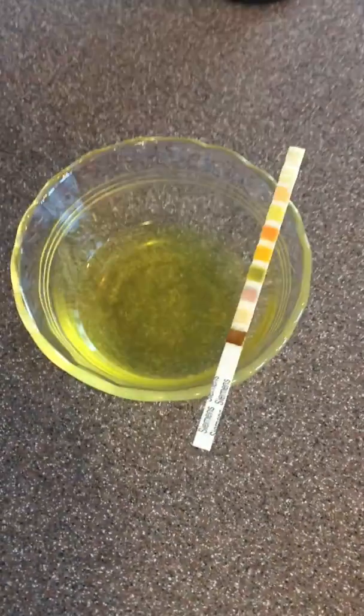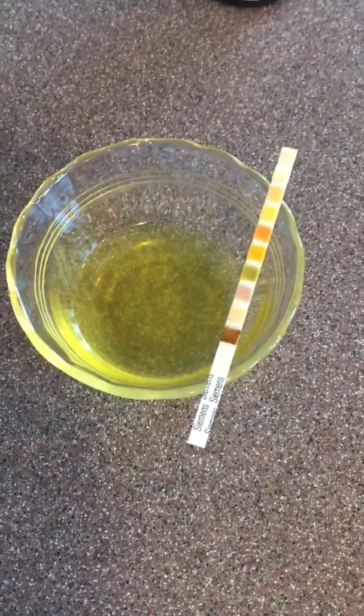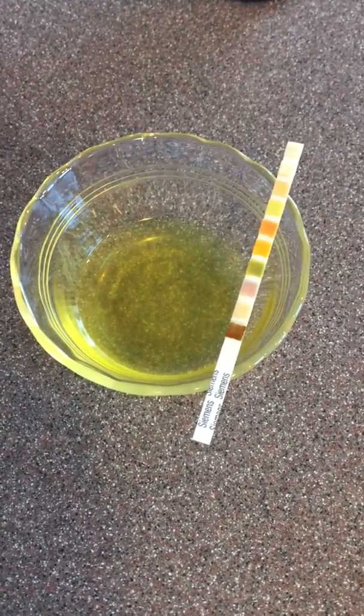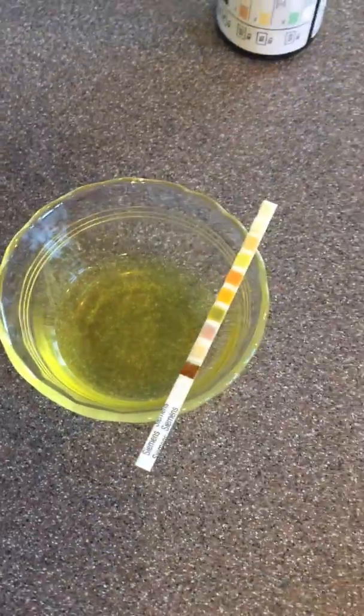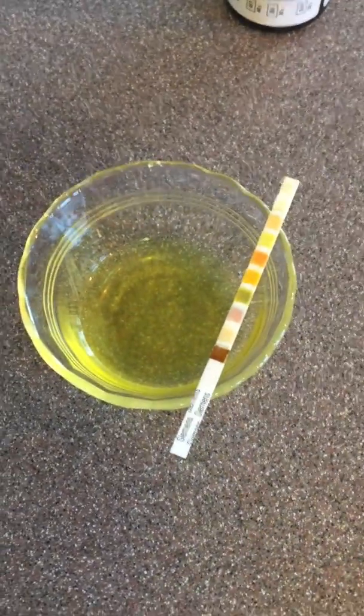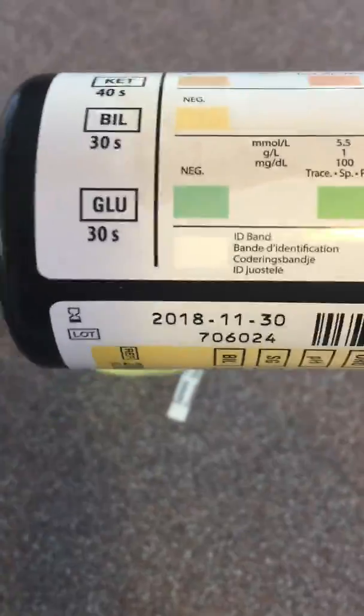You can, once you collect this urine, refrigerate it for up to 6 hours. But testing it right away gives you the best result. First morning. Yep, and first morning urine is your best, your strongest. So we're testing here in the afternoon, but it's pretty clear that there's glucose in that urine. That brown spot at the bottom should be a light green that looks like that and does not.